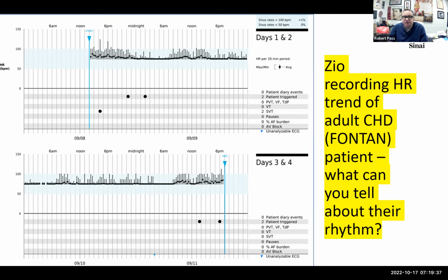And the other thing is that if the device is in the abdomen, it tends to not detect motion as well as when it's in the shoulder. But you can make these devices more sensitive. But in my experience, most patients hate that feeling, even though the degree of change in the atrial paced rate will be very similar to that of or even less than that of a sinus node. Most patients who are used to being paced within a certain heart rate range become very, very uncomfortable if you make it even a little more sensitive.